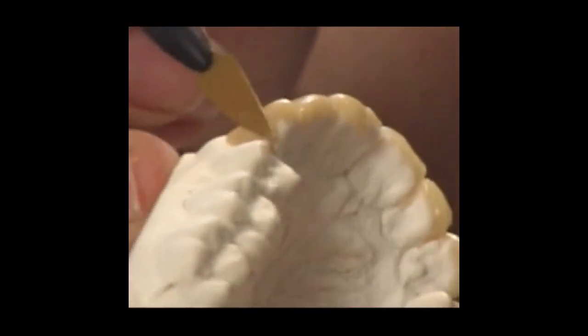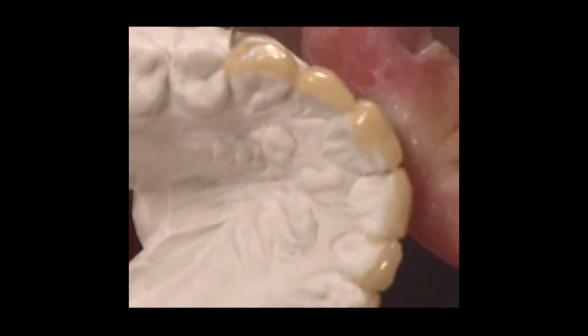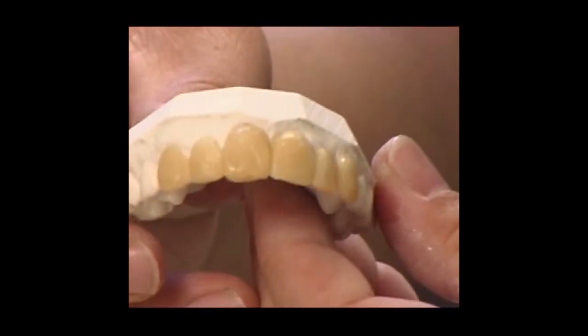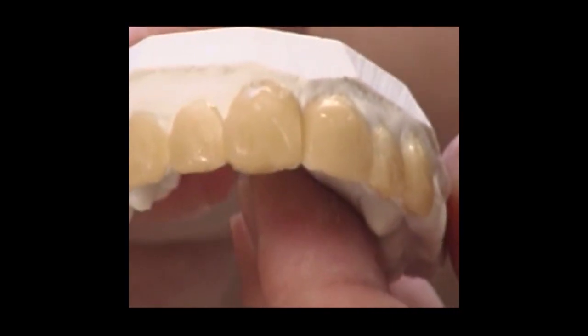Look at the way the cuspid is. We have to make a little bit more adjustment. Wrapping around, try not to go over the other side of the tooth. That way your sizing is approximately in the boundary that we want it to be. Oops, the gingival area is up a little. Next, we cure the composite. And simply it's hard. So this is a final product like it, or even bigger than the way we want it to be, but this is the way we make this one for temporary.